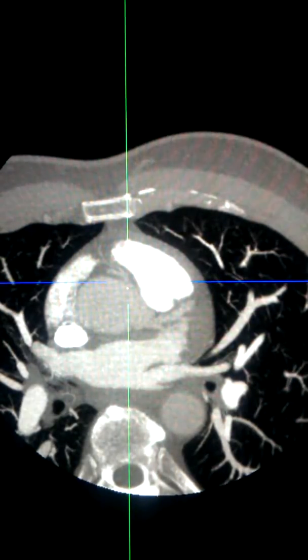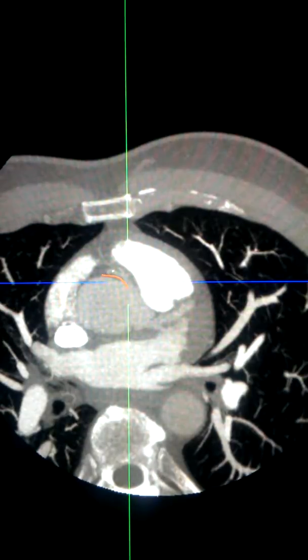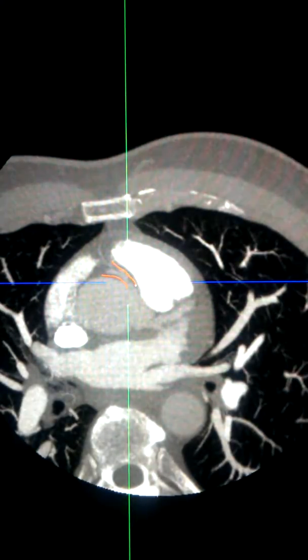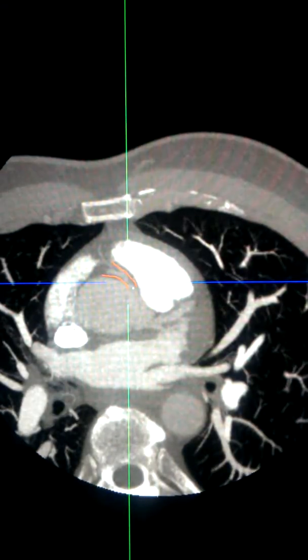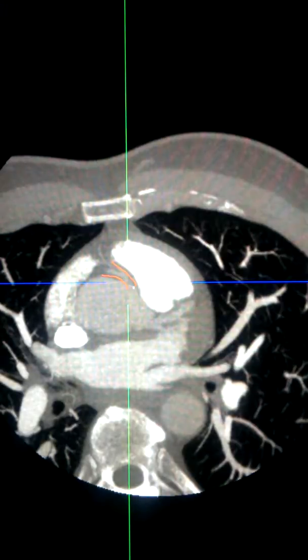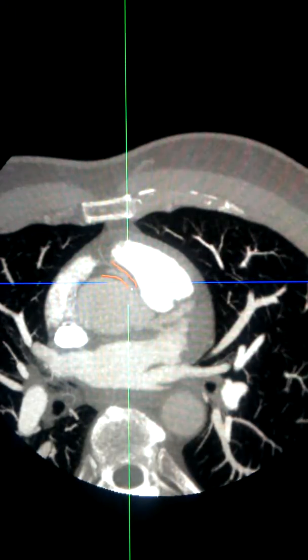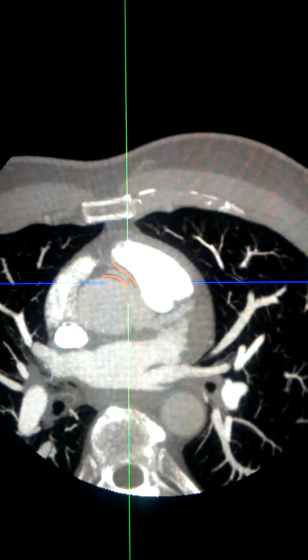We will be drawing the outline of this artery, and as you can see, the right coronary artery arises at a more leftward origin, albeit from a separate ostium, and traverses between two high-pressure chambers.